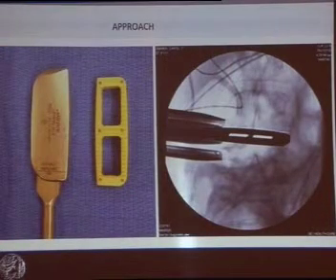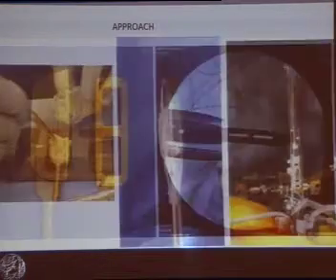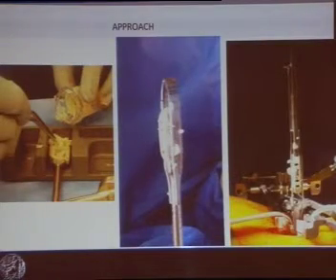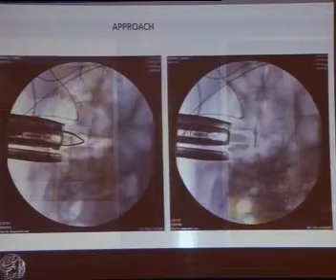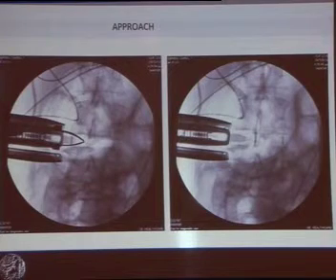The cage height, depth, and length are measured with trials. The cage is filled with BMP2 or DBM and is inserted using a special device that secures the bone graft substitute during cage placement. Cage insertion should always be performed under fluoroscopic guidance.